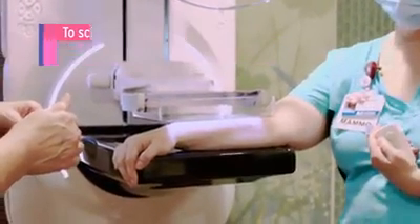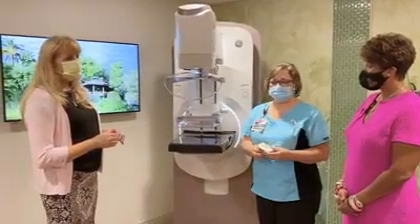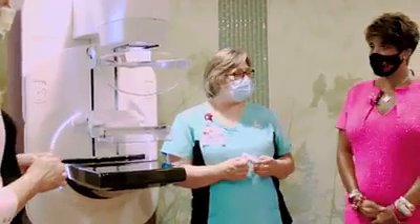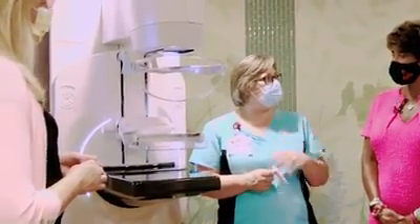We really want to put that control back into the woman's hands so she understands this doesn't have to be a painful experience. That's wonderful — I'm sure the patients are liking that much better. It takes a lot of the anxiety out of the exam for the patient knowing that they have some control over when that compression will end.